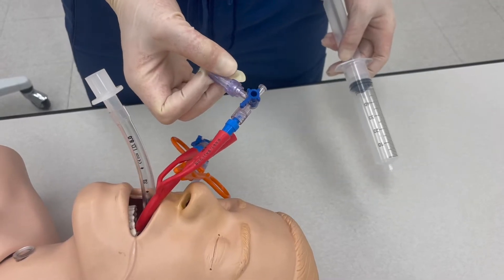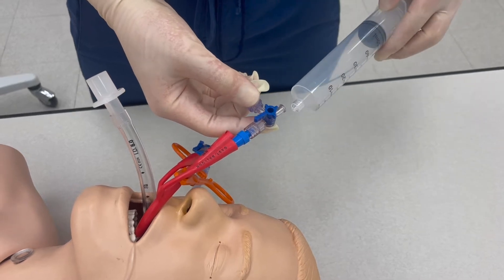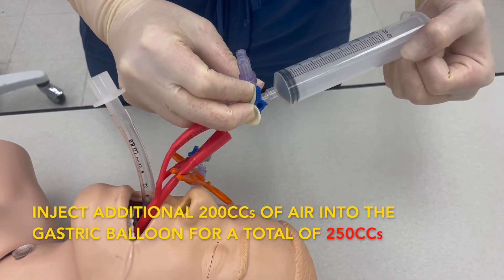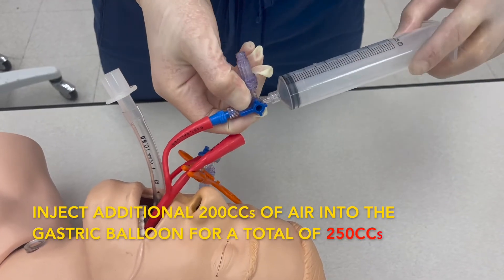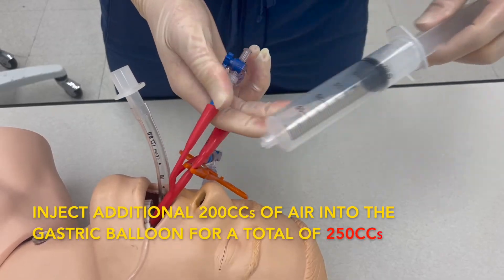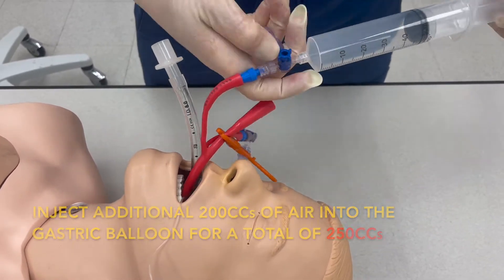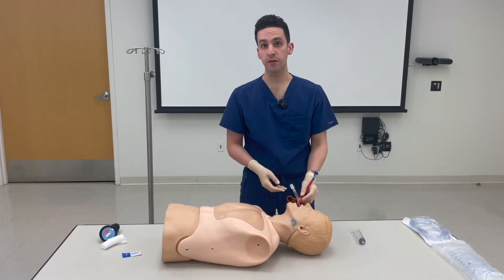Once you confirm proper placement of the gastric balloon, insert another 200 cc's of air into the gastric balloon. Each time, turn the valve so you secure that no air leaks. Remove the syringe and refill with another 50 cc's. You now have a total of 250 cc's of air in your gastric balloon. Pull back until you meet resistance.